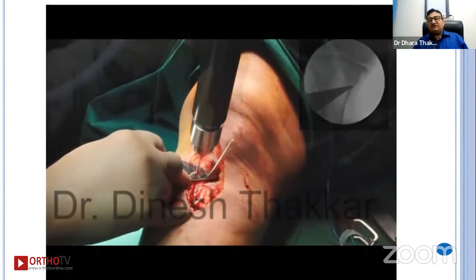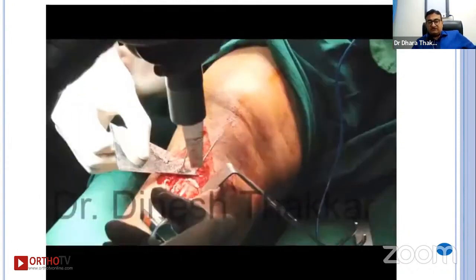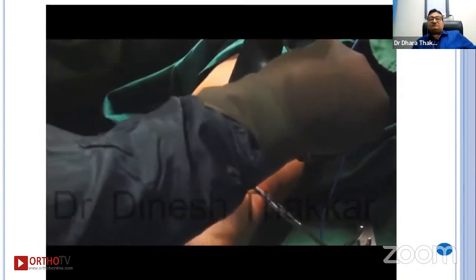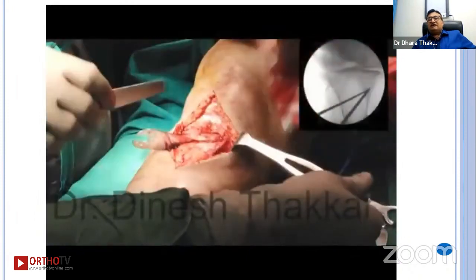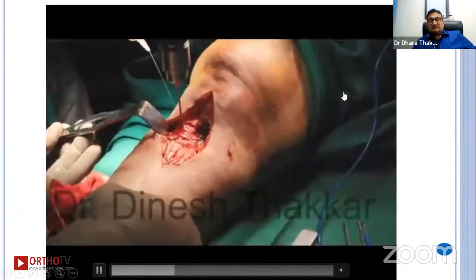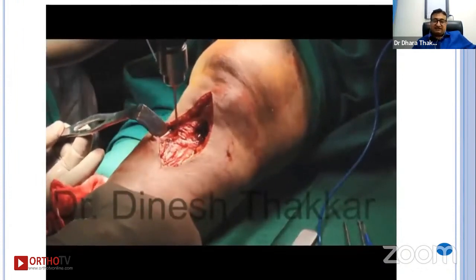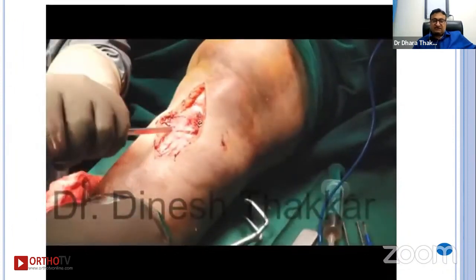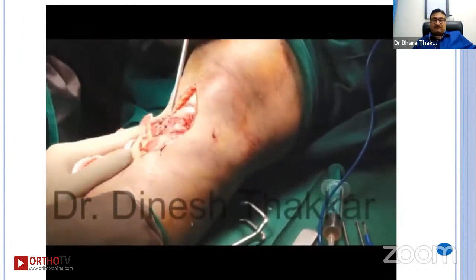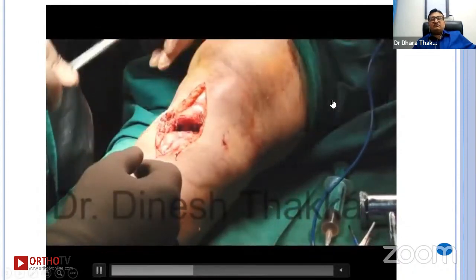Then I fix it with two K-wires on the proximal tibia. This is the proximal cut of the osteotomy, and this is the distal cut of the osteotomy. Here in the sagittal view, we can see how the wedge is to be removed. After that, I separate the lateral cortex. I have not yet detached the soft tissue attachment of the lateral cortex. After making multiple holes in the lateral cortex with a K-wire, I separate it out with its vascular attachment. Like this, we can see this piece has been separated, and then the wedge is removed like this.